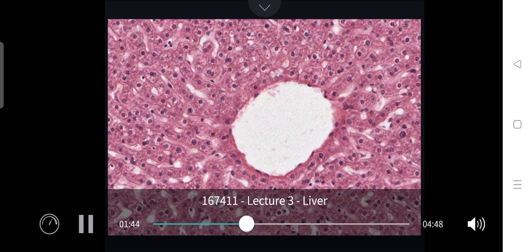The central vein will be located in the centre of the lobule and has little more than a sheet of endothelium for its wall. See the flattened nucleus of an endothelial cell here and here, with a minimum of connective tissue, which is collagen, that is not really resolvable that clearly here.